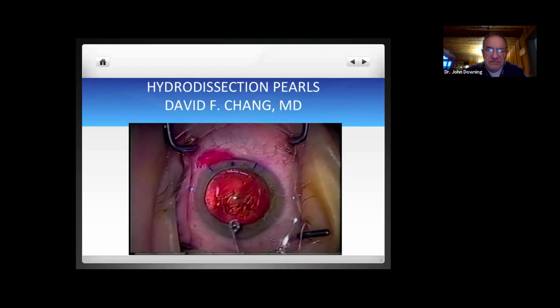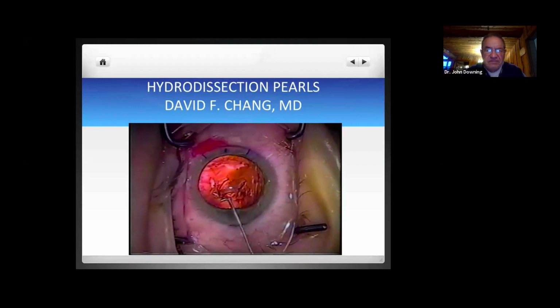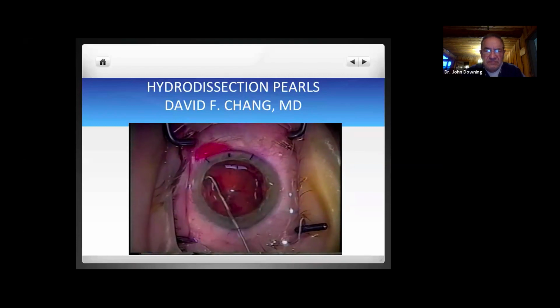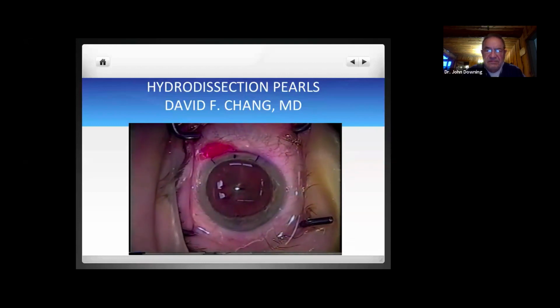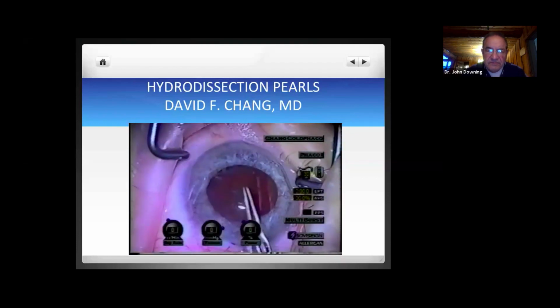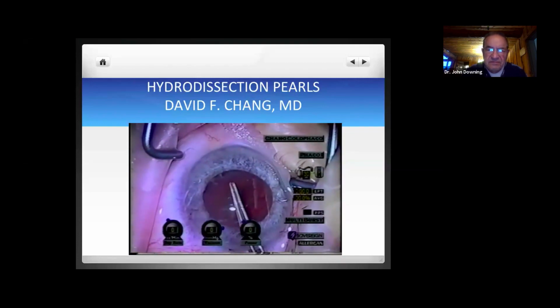The one thing to be avoided is having a brown lens such as this move right up into the back of the capsulorhexis, creating capsular block. And if you were to overfill the bag, it is possible to blow out the posterior capsule. So you see, right after that first wave, typically it is used to compress the nucleus posteriorly, breaking the capsular block.